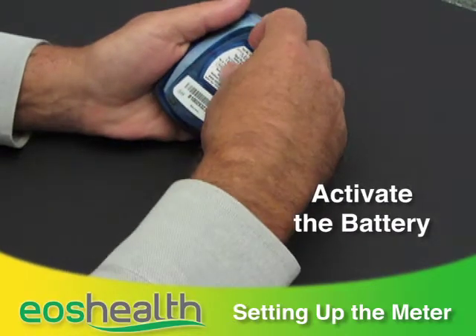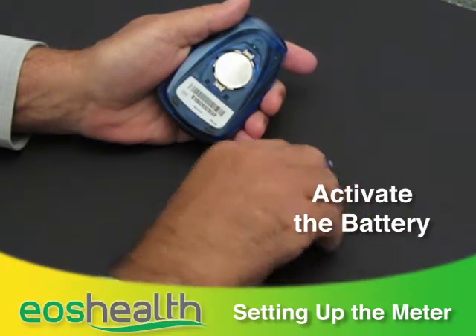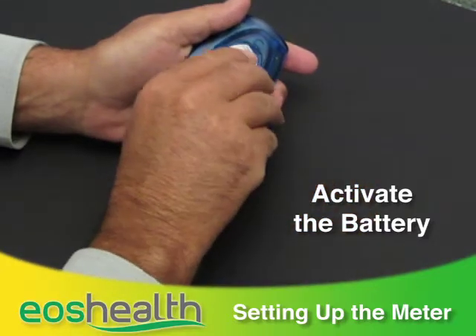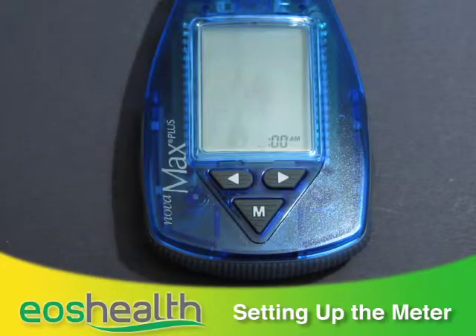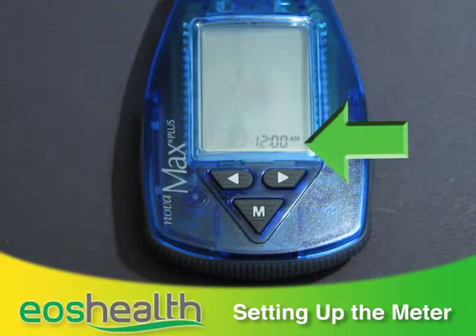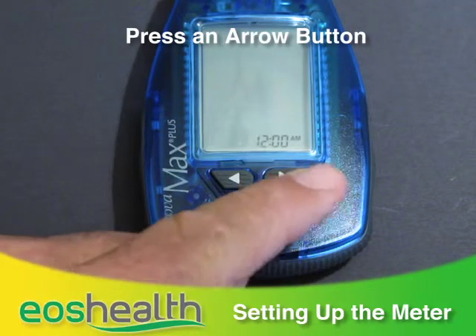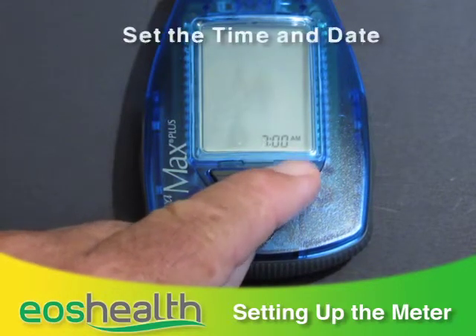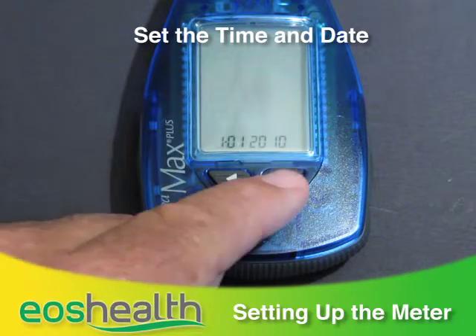The very first time you use it, turn the meter over, remove the battery cover, and pull off the plastic tape to activate the battery. Then replace the battery cover. The monitor will light up and then display the time setup screen. The hour number will be flashing — press the left or right arrow button to choose the current hour, then press the Mode button to confirm and continue on for the minutes.